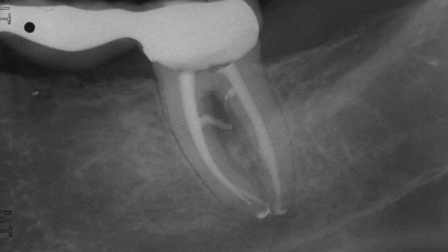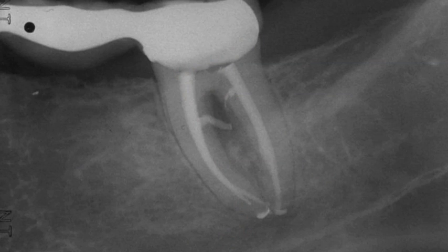And if you look at the apices of these teeth, you'll see several portals of exit that were obturated because my irrigation solution got down to this area and cleaned that area. But it was not just the needle that got down there, it was the EndoActivator that allowed that solution and the hydrodynamic action of my irrigating solution to get down to that area and clean those portals of exit. Thus, we see them obturated and a wonderful result.